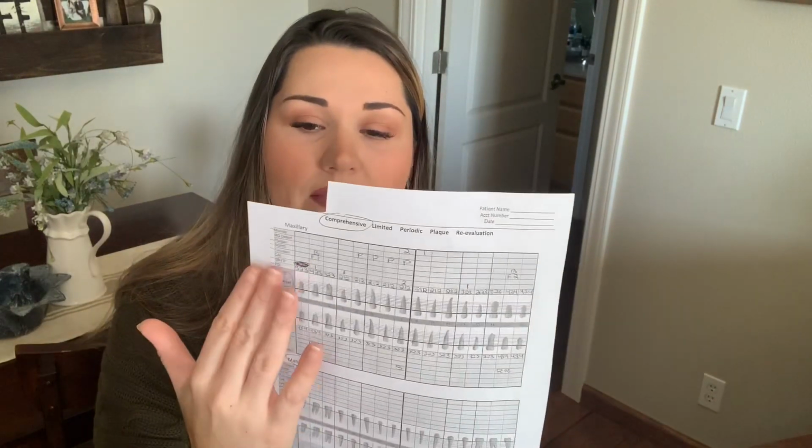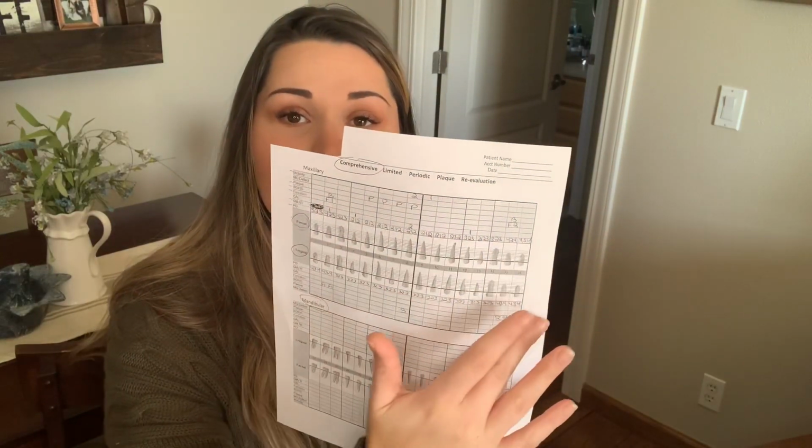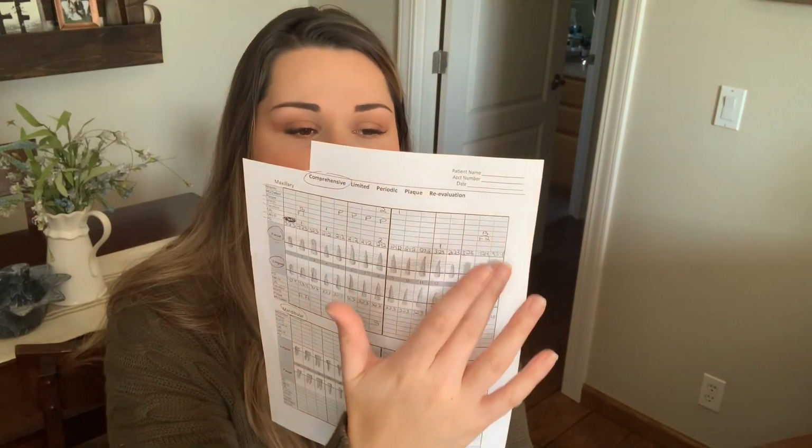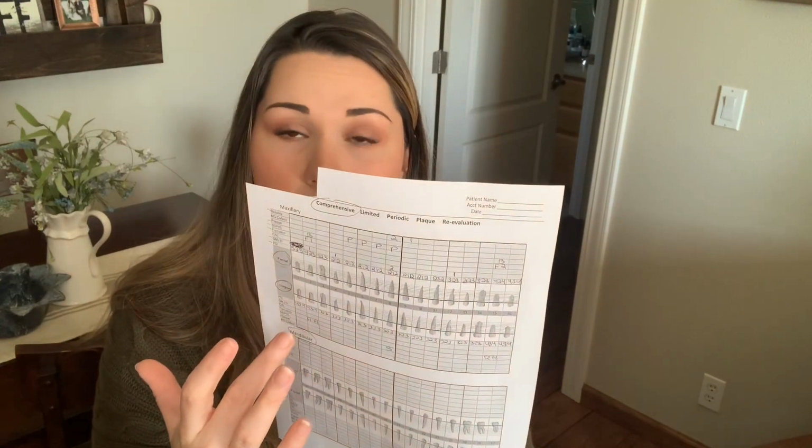And you're going to be typing this in or entering it on this piece of paper. And like I said, you can go all the way through the facial, and then she's going to loop around into the lingual side. So usually they'll drop down into number 16 lingual, all the way through number 1 lingual.